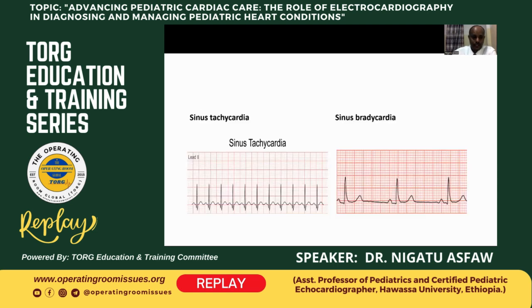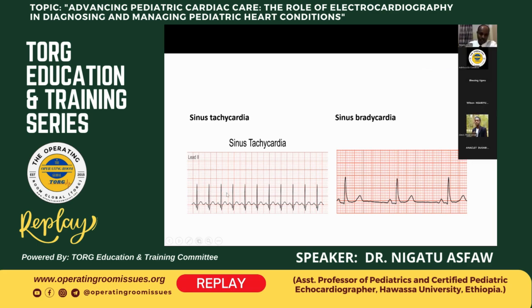And on this ECG, the leads show sinus tachycardia. The heart rate is roughly around 150, as the RR interval is regular and there are 2 large squares, so we divide 300 by 2, that will be 150, and there are P waves preceding every QRS complex.